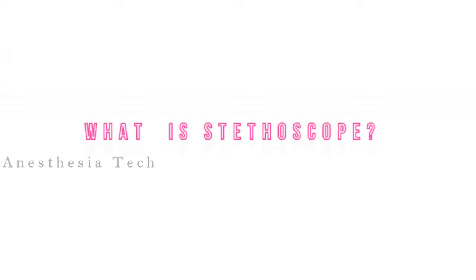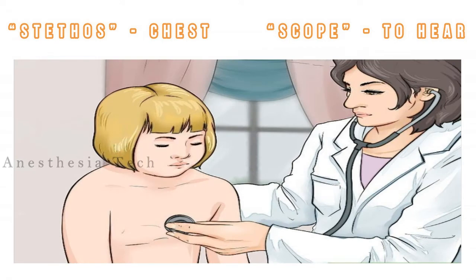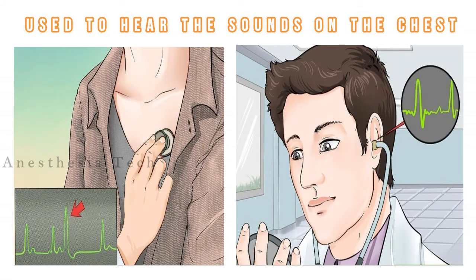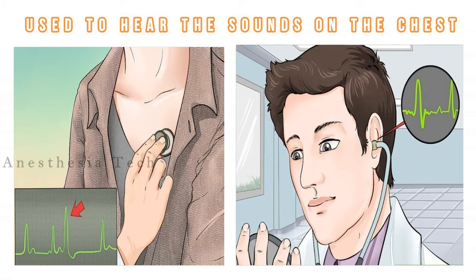First of all, we'll know what a stethoscope is. Stethos means chest, while scope means to hear. In simple words, a medical device used to hear the sounds on the chest is called a stethoscope.